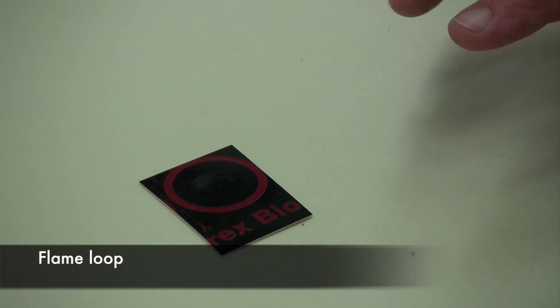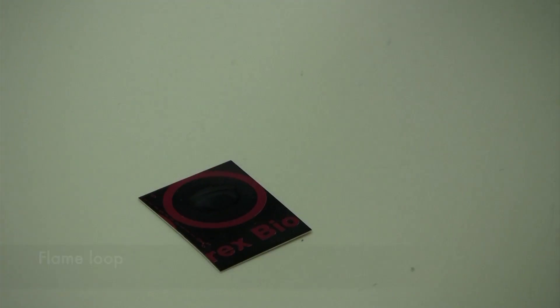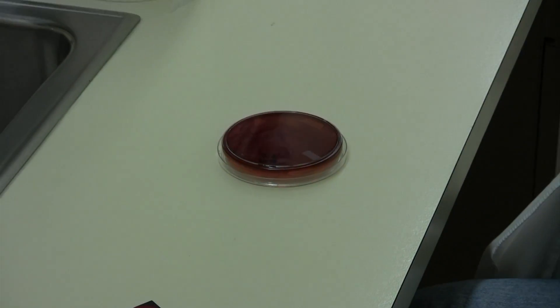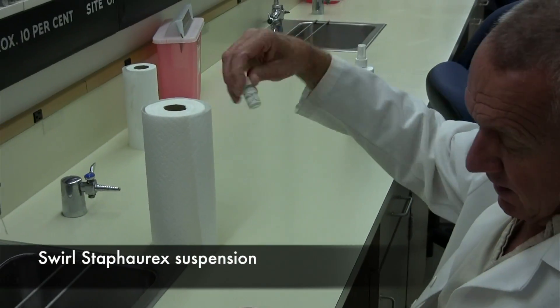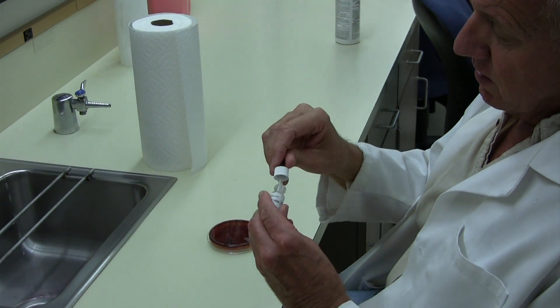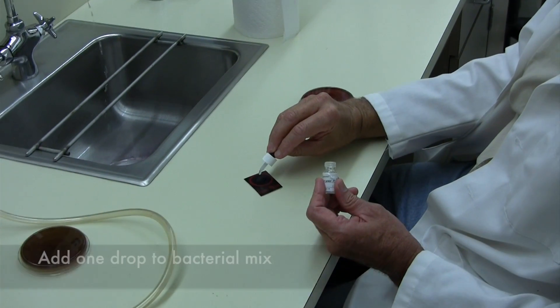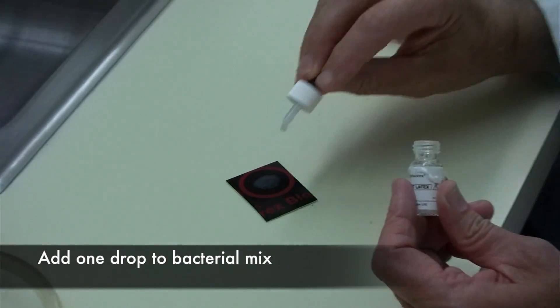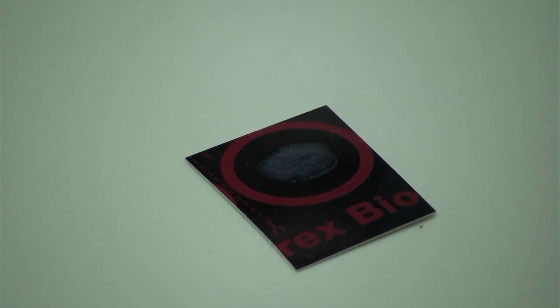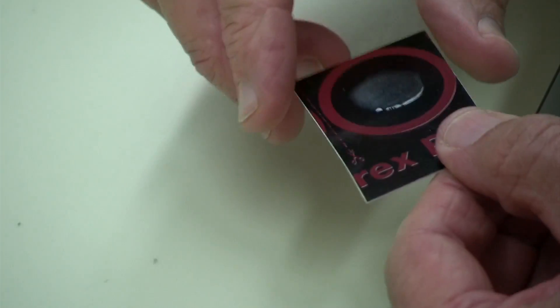Then the next step will be to add one drop of the reagent to the suspension. Place one drop on the slide and rock the slide for about 10 seconds or so, looking for clumping.